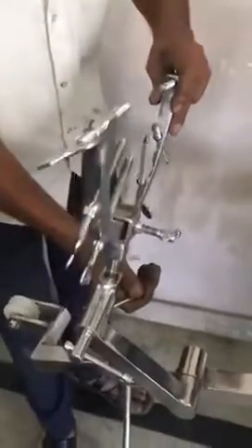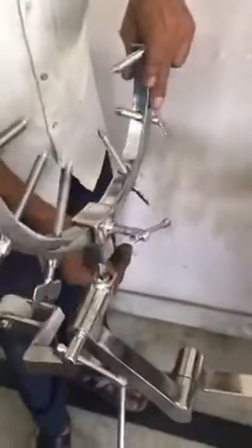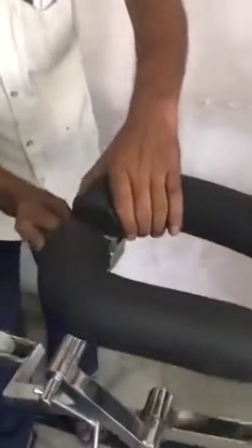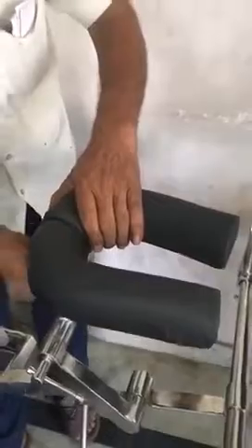Ball and joint socket. Next we will move with a different attachment which is called a horseshoe. Here we have the horseshoe. It has great traction and is also built in SS304 with high quality mattress. Like the previous one, it can also be moved left and right for the ease of the patient.